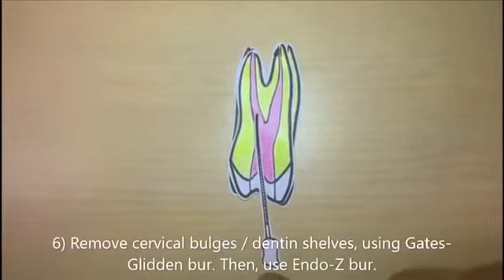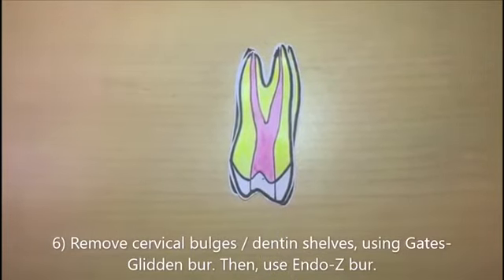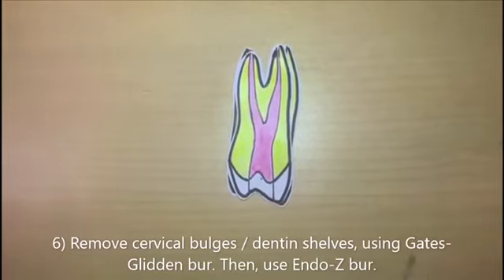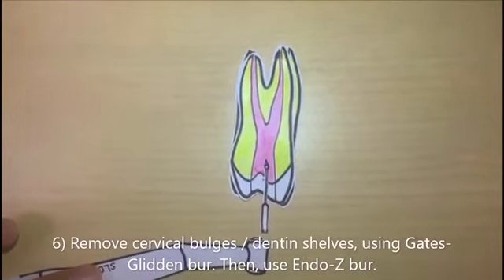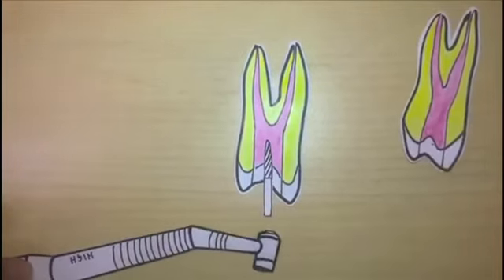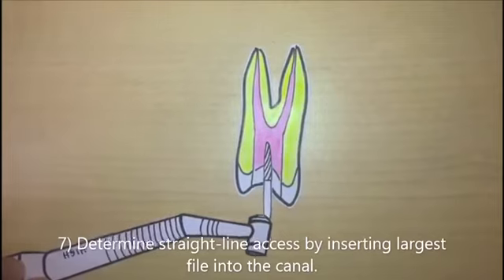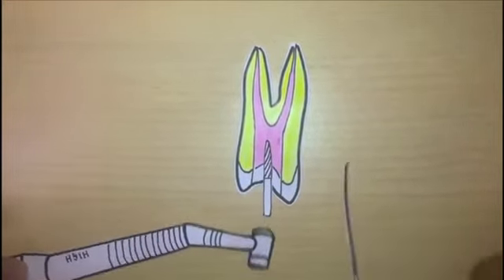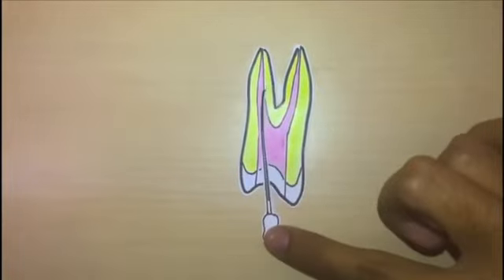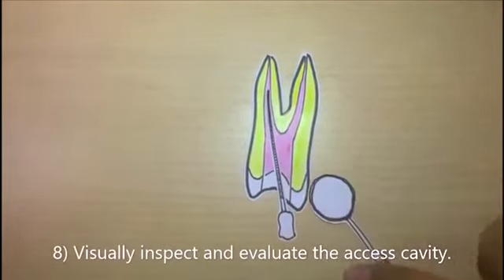Remove cervical bulges or dentin shelves using carbide burrs or Gates-Glidden burr. Then use endo-Z burr. Determine straight line access by inserting the largest file into the canal. Visually inspect and evaluate the access cavity.